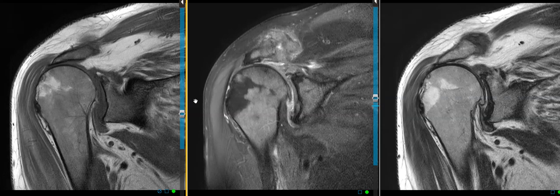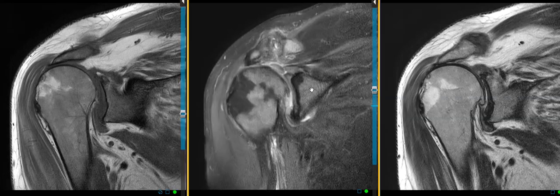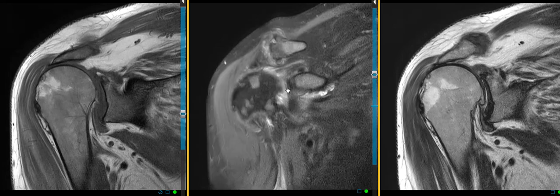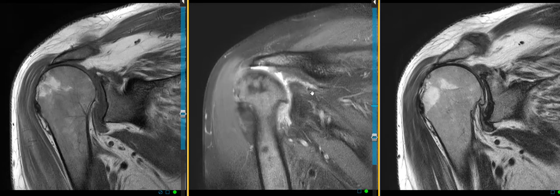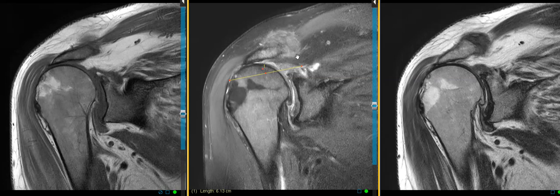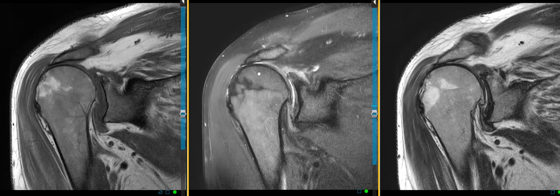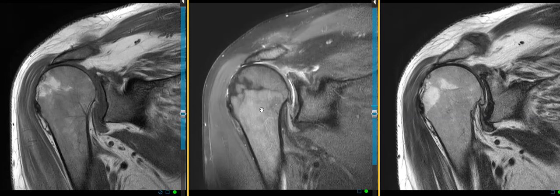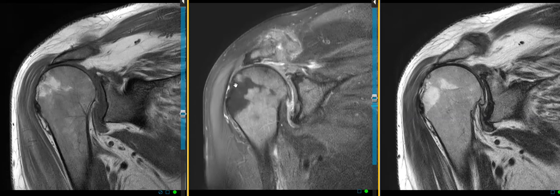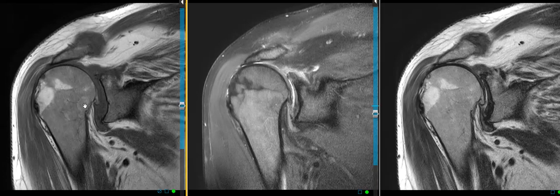When we see this, one thing we think about is marrow infiltration from leukemia or multiple myeloma — leukemia would be the number one thing. Talking to the physician, the patient did have a history of leukemia almost eight years ago; he had been treated. Now we see this diffuse bright signal on this fat-suppressed sequence: the subcutaneous fat is dark, and the fat in the marrow is also suppressed — except for in this one region here — so the marrow is just appearing bright because there is no fat to suppress.